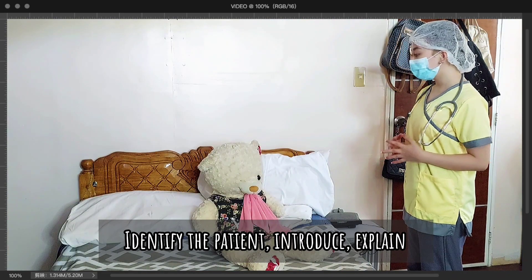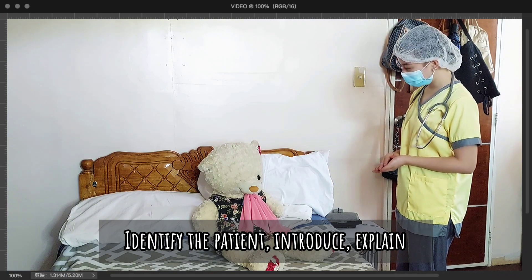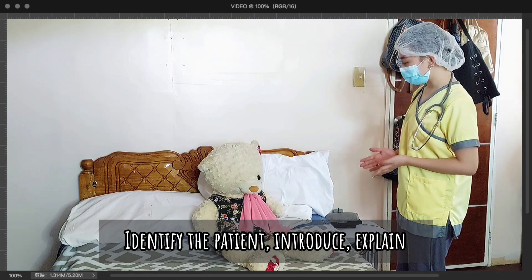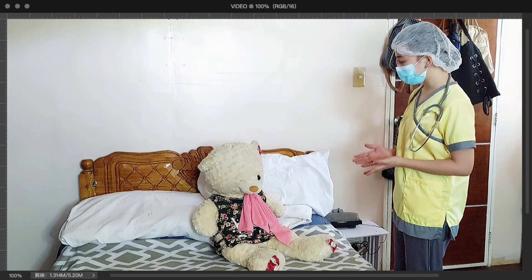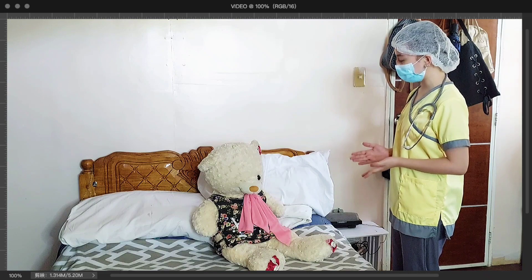Good day, Ma'am. I am your nurse for today. You can call me Nurse Roxane. May I know your name, Ma'am? Ma'am Max Payne, today I will render a fundal massage to control your vaginal bleeding and encourage uterine contraction.